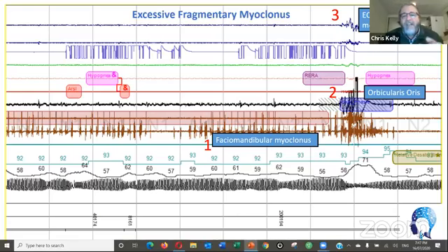And then you've got your airway event, and the third thing is you're getting slow eye movement, which is different to REM. REM is rapid eye movement, and slow eye movement is akin to an alpha wave thing. So that's an arousal-based eye movement. It doesn't detect REM though. And this sort of thing is happening all the time.